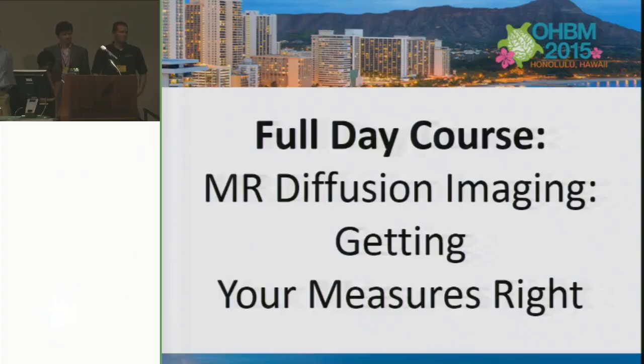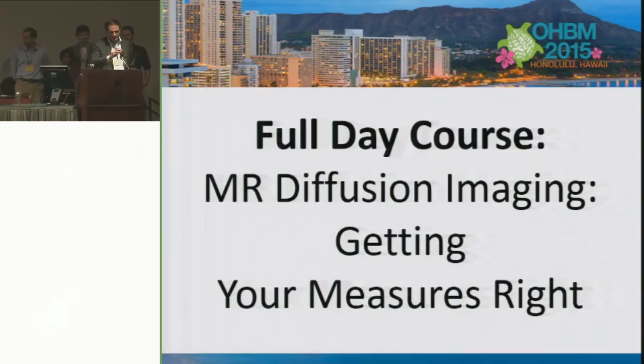Sure. When you're screening for motion and all different pre-processing things, it's good at least to try to get through the review process to all agree on certain types of practices. And so when you do identify bad gradients that you want to remove, it would be nice to have some type of rule of thumb that if more than 4% of your gradients are bad, toss the whole subject. If less than 4% are bad, just toss the gradients, and then we could all follow that. So it's a good idea.